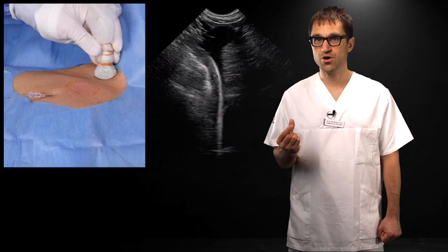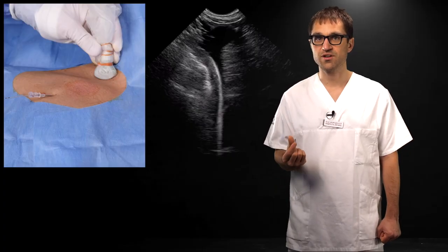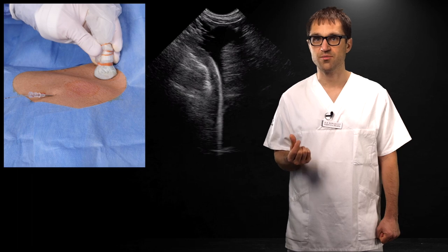The microconvex probe takes some getting used to. When we teach this, we see that trainees often lose their orientation due to unintentional rotation of the probe. A firm, comfortable grip and resting your wrist against the patient's shoulder will help you overcome this.